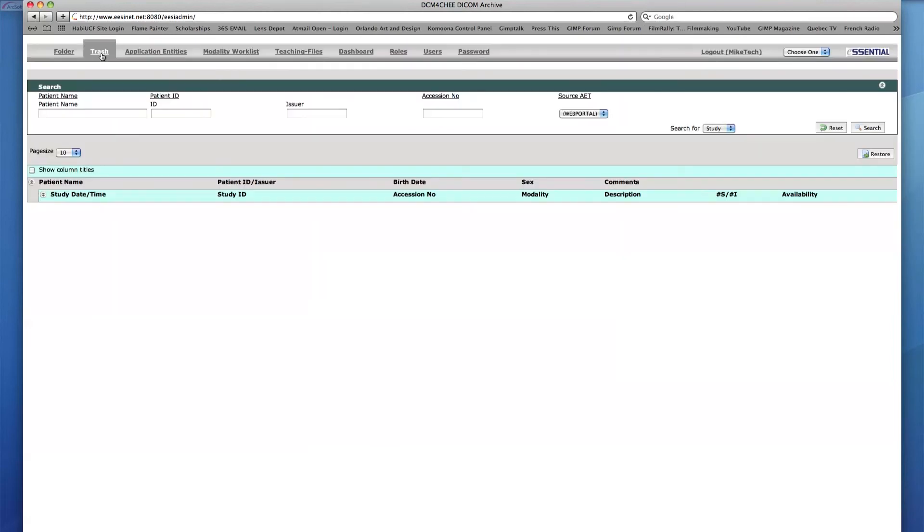In the Trash tab, a set of icons labeled Empty Trash and Delete Permanently are removed to restrict any of these actions. This particular user can only view or restore items in the trash, but not delete those items.